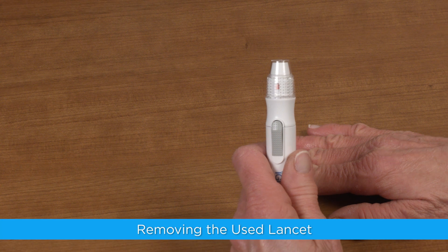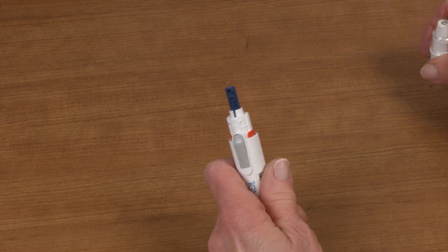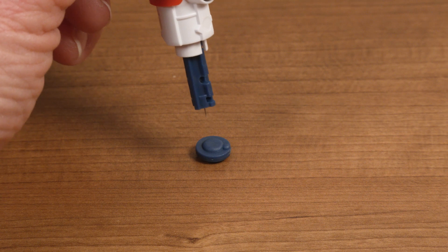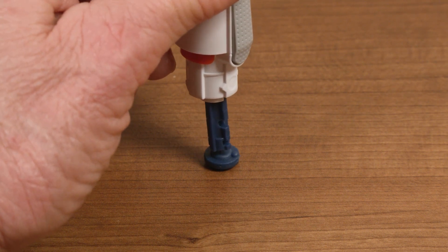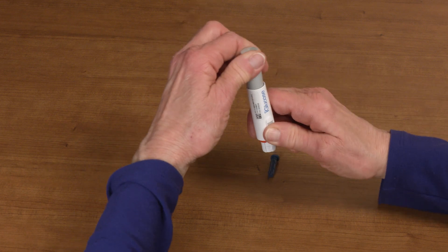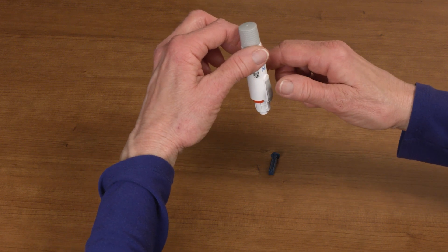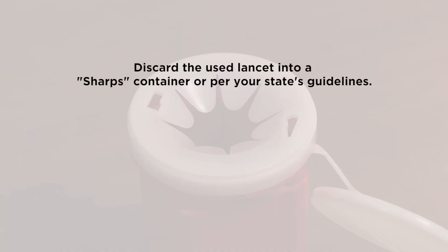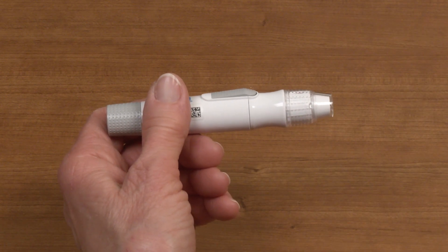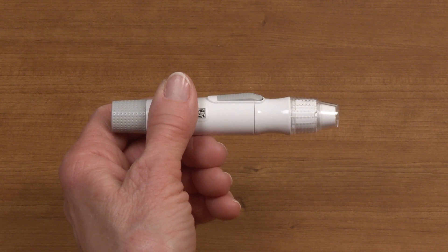To remove the used lancet, pull off the cap of the lancing device. Locate the protective lancet cover you set aside earlier. Without touching the used lancet, securely insert the sharp lancet tip into the protective lancet cover. Hold the release button of the lancing device with one hand and pull on the plunger with the other to safely eject the used lancet. Discard the used lancet into a sharps container or per your state's guidelines. Replace the lancing device cap.